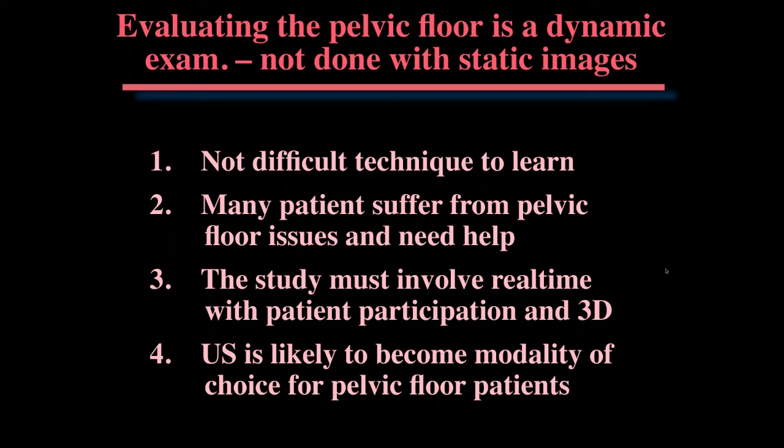I don't know how, they must have a method which I'm not familiar with. But I find that using the transvaginal probe is fine, and it also gives you the option of going in a little ways if there's something that you find that's halfway up or whatever. It gives you a chance to do that.